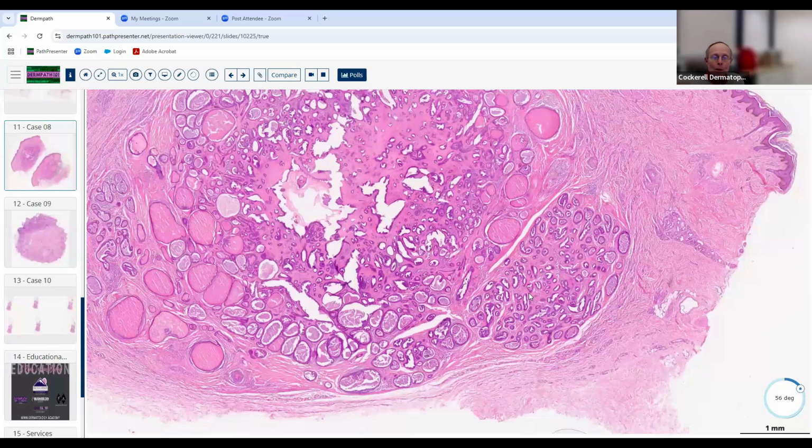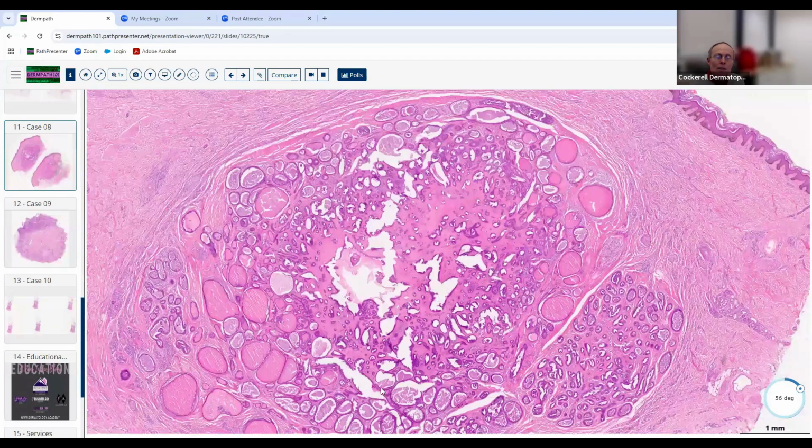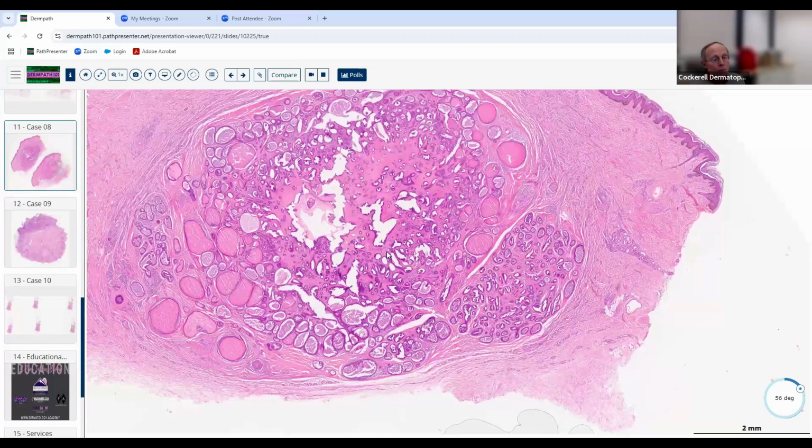Tubular apocrine adenoma. If you see multiple small individual cyst-like structures with apocrine differentiation in a small, round, well-circumscribed lesion, so it looks like a bunch of tubes with apocrine differentiation, that's the diagnosis. If they put hidradenoma papilliferum here as a choice, do not choose that. It has two features in common with that: it's endophytic, in the dermis, and has apocrine differentiation. But it doesn't have the papillomatous configuration, and it doesn't have the plasma cells that we saw before with the Syringocystadenoma Papilliferum.